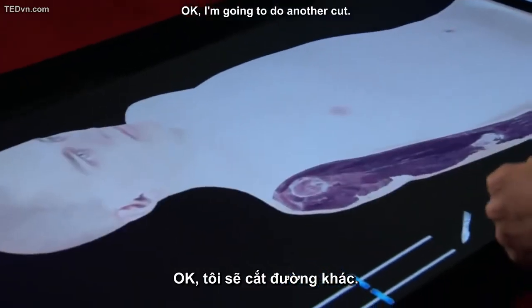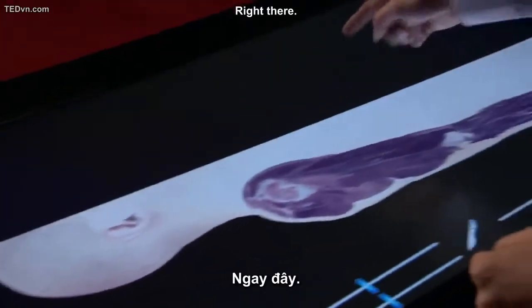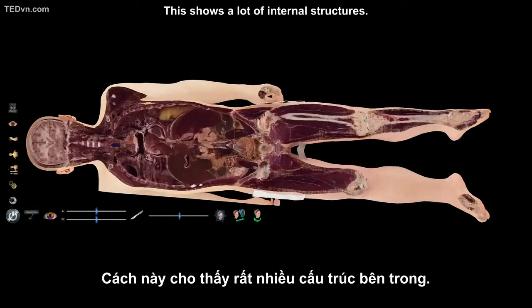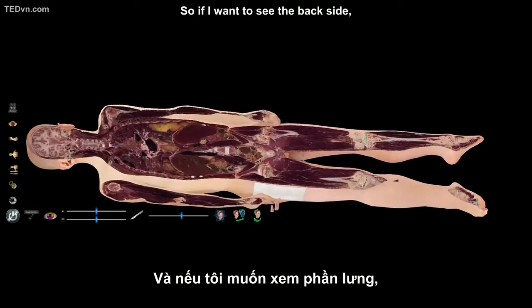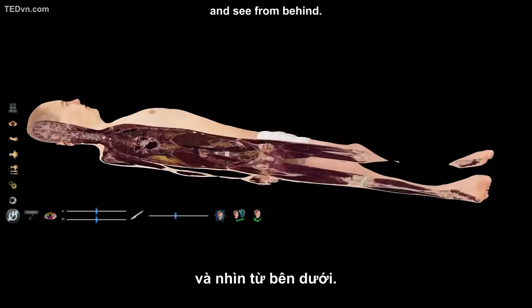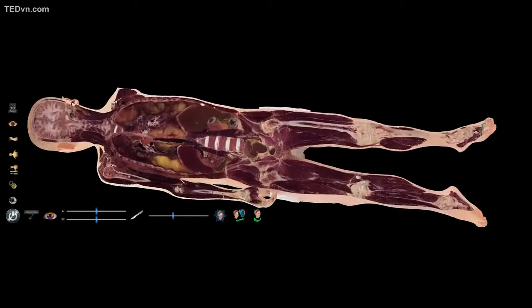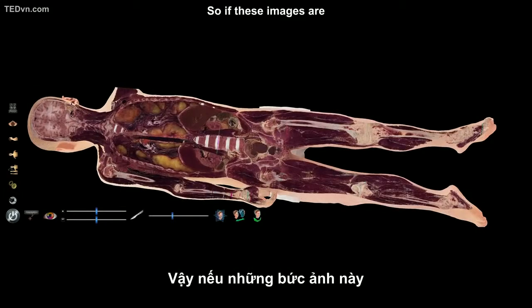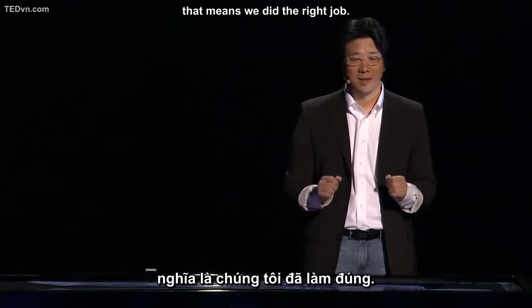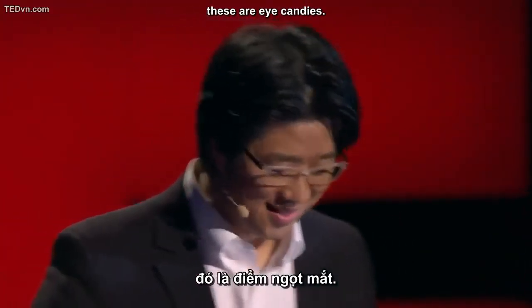Okay, I'm going to do another cut. Right there. It shows a lot of internal structures. So if I want to see the back side, I can flip and see from behind. Like this. So if these images are uncomfortable or disturbing to you, that means we did the right job. So our doctor said, these are eye candies.